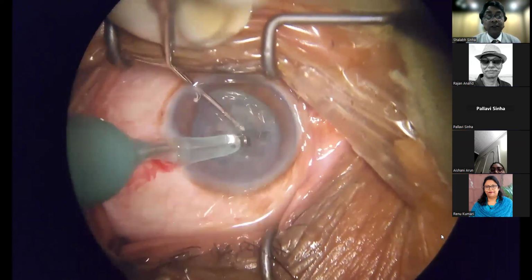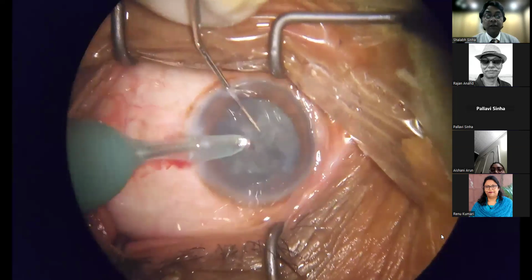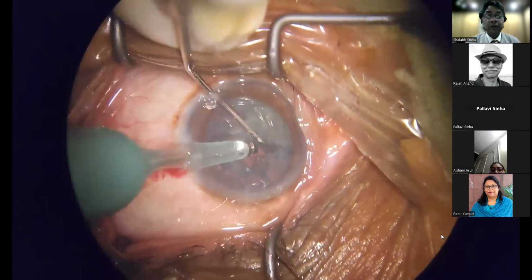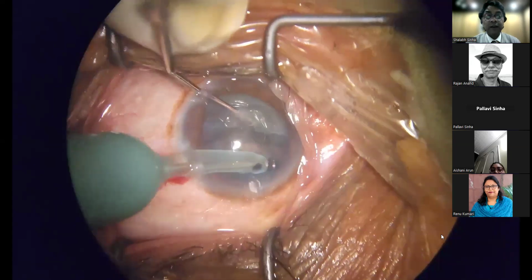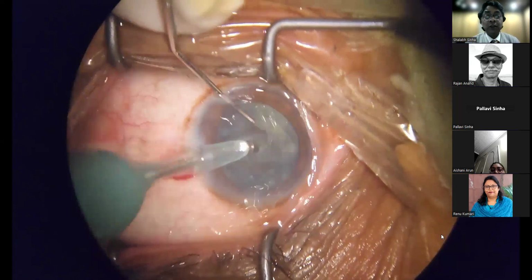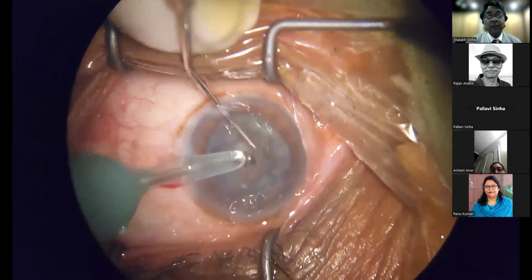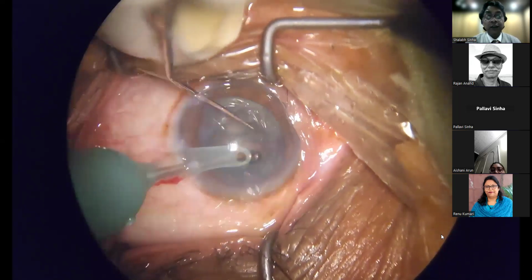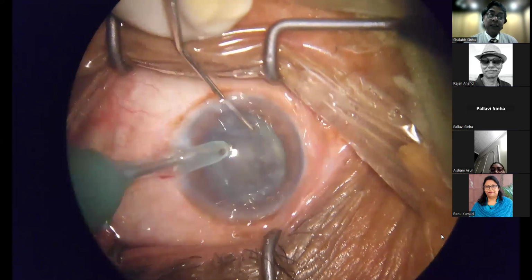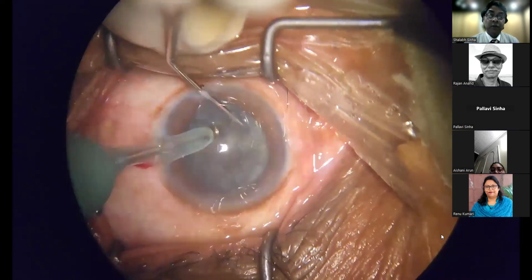So a central trench is fashioned and it is divided. The nucleus still does not rotate completely. So a little bit more of the trench is deepened to allow some fluid to go behind and allow the nucleus to rotate. So I tried to catch one pole of the heminucleus, but since the entire nucleus hasn't divided properly, it wasn't easy to hold it.